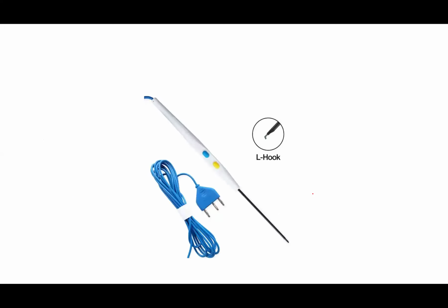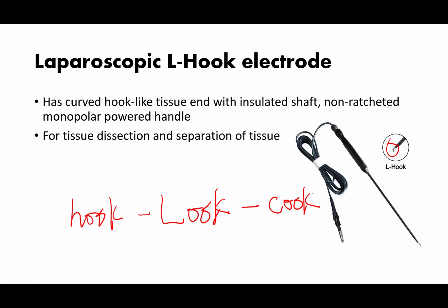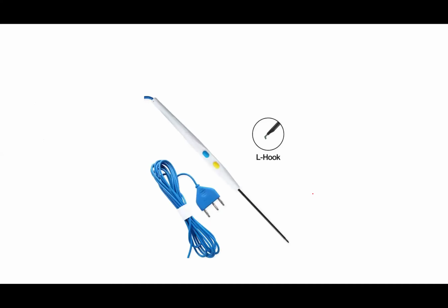Now, sometimes the L hook can be connected to a diathermy pencil depending on the size of L hook you have. Some surgeons prefer to use the handheld device, while some prefer to use the other type we showed, using the foot pedal. So if you are using this type, you can use your normal diathermy. So if you are used to the diathermy, you can get a smaller size L hook so that it fits into your diathermy pencil.